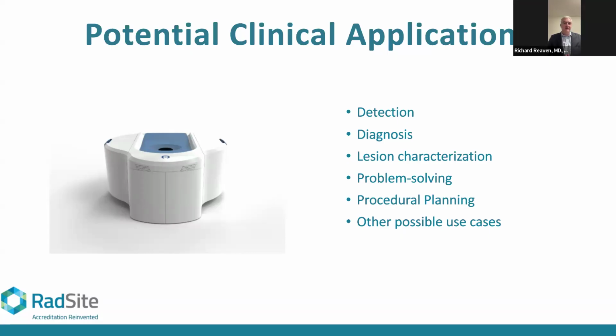One of which is they are concerned that the compression associated with traditional mammography may rupture their implant or the capsule around the implant and could potentially cause disfigurement. They spend a lot of money on these implants a lot of times, and they don't want to have a cosmetic malfunction based on the actual test that's going to try to diagnose their breast cancer. And so a lot of people just don't currently get mammography as a result.